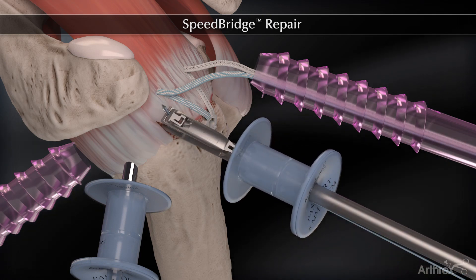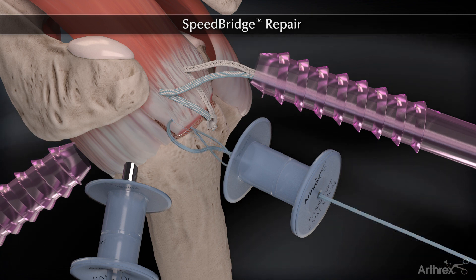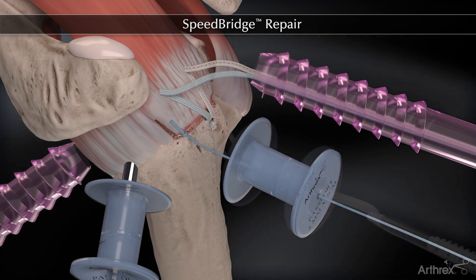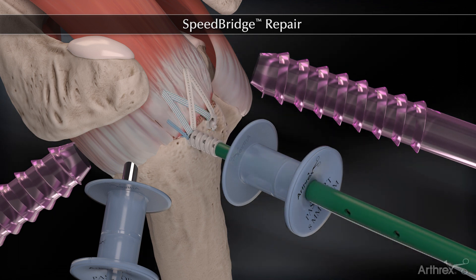If a dog ear is anticipated, it can be reduced using a fiber link suture passed in a cinch stitch configuration. The fiber link and two remaining fiber tape tails are all secured with a second lateral swivel lock anchor.